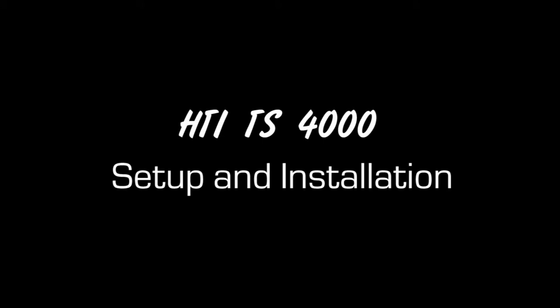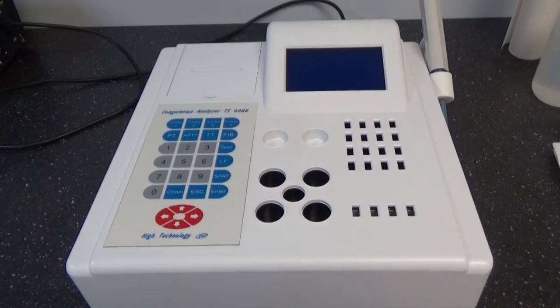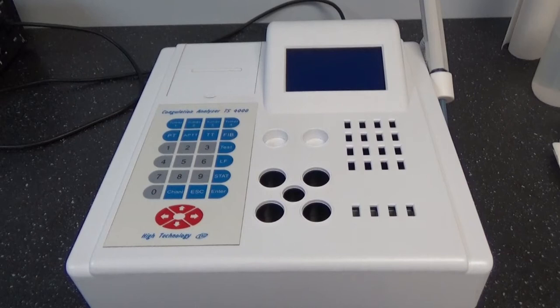The HTI TS4000 is a semi-automatic coagulation analyzer. The analyzer has a thermal printer, keypad, LCD screen, 5 pre-warming reagent positions, 2 room temperature reagent positions, 16 preheated sample positions, and 4 test channels.